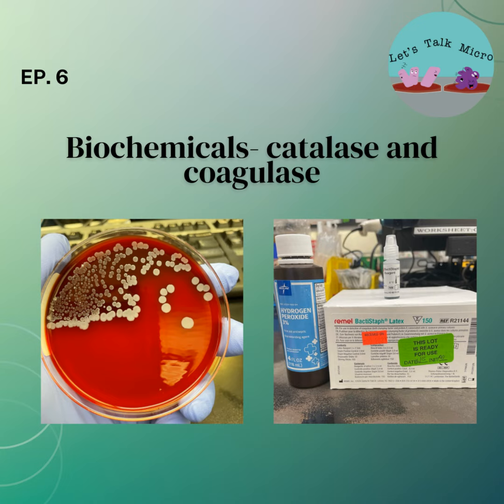So I know most of you out there tend to be the visual type. So flow charts are always very helpful when you're dealing with these biochemicals. If you were doing a flow chart of your gram-positive cocci, catalase will be at the top. That's the first thing you do. You do a catalase test. Mind you, in the clinical labs, as you get more experience, you can tell a staph from a strep.